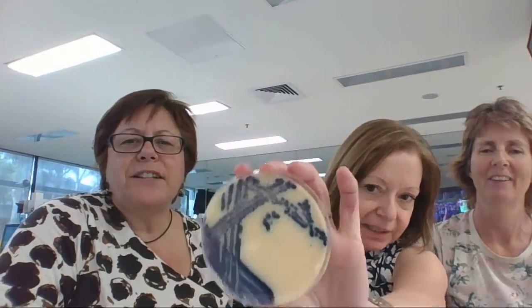So it's not bad. And while we were talking about the urine bench, we mentioned the horse blood MacConkey split, which is what I used to use, but nowadays we're using something, look at this. Isn't that beautiful? For example, this is a Klebsiella. Wow, what a difference. Completely different.